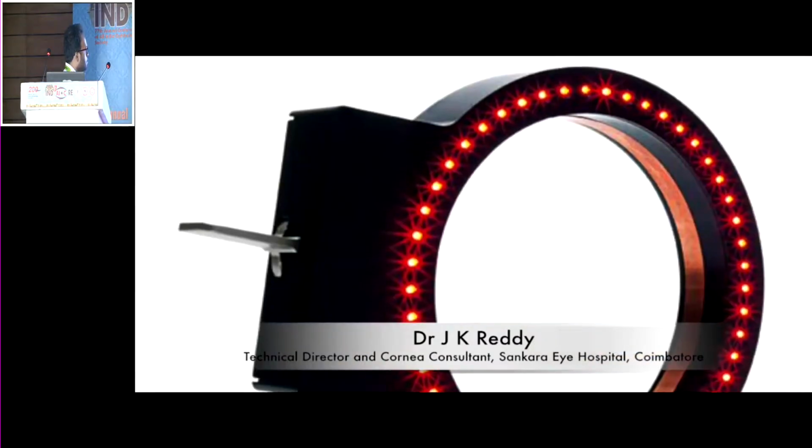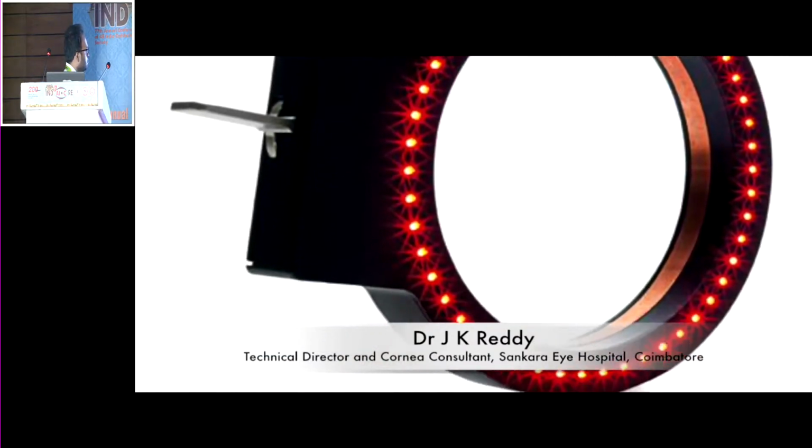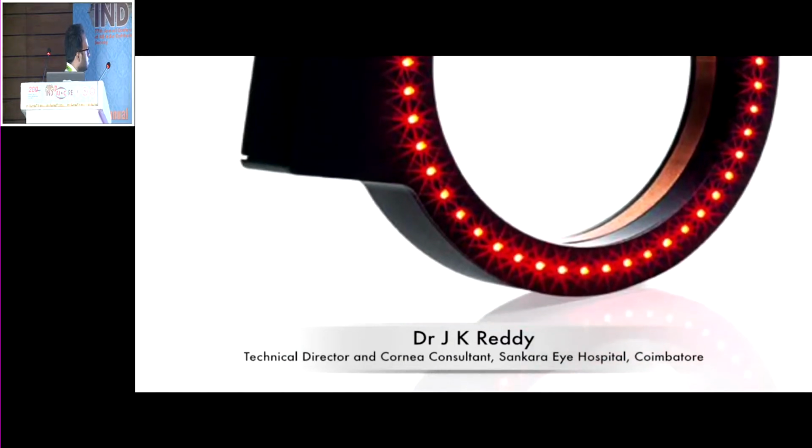And you take the other one from Leica. This is a very small zone. It forms a very small central point reflection on the cornea. So you cannot use this one, and you got distinct spots of lights. So you don't have a clear-cut round line. So these are the limitations of present keratoscopes available. The other one, you take it here. There are three rows of light and three lights. So when you put a suture, the suture will come from here. So it's impossible to use this one as a guide. It doesn't help in corneal transplant surgery.